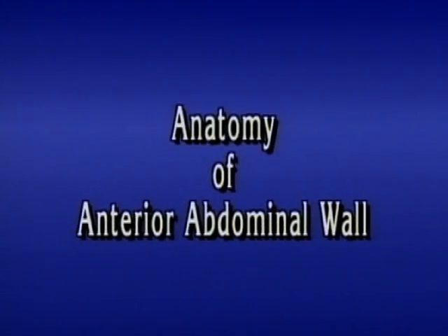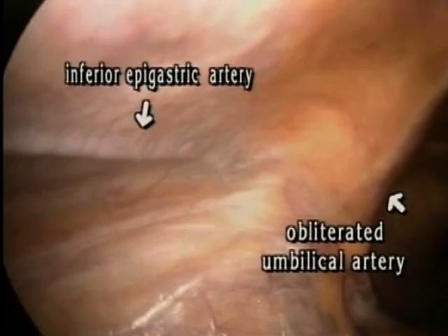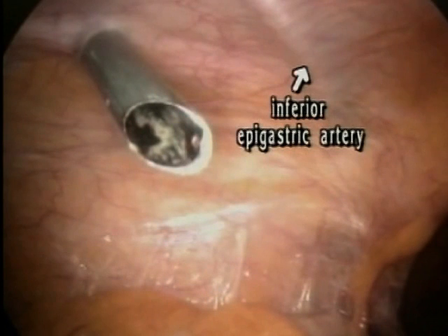Laparoscopy provides a unique opportunity to view pelvic organ anatomy. During any laparoscopic surgery, inspection of the anterior abdominal wall is a prerequisite for safe insertion of the trocars. The important anatomic landmarks are the obliterated umbilical artery and the inferior epigastric artery. A palpating finger exposes these structures and precisely localizes the trocar entry site lateral to the vessels.